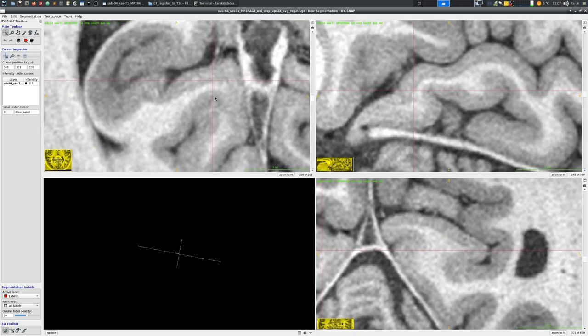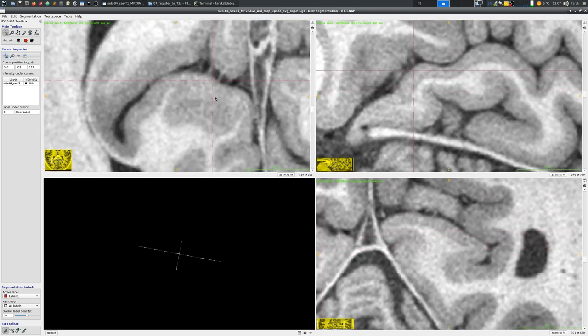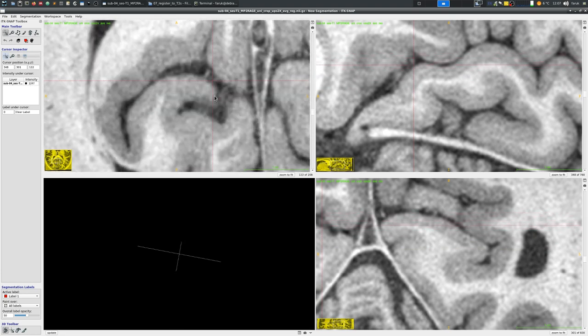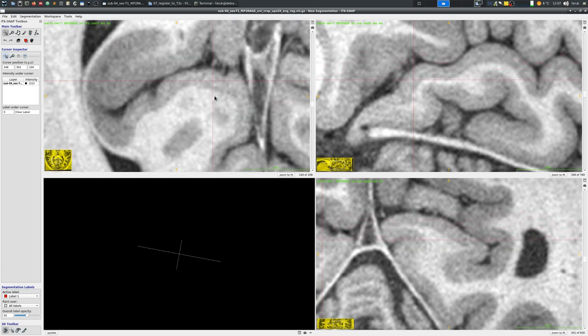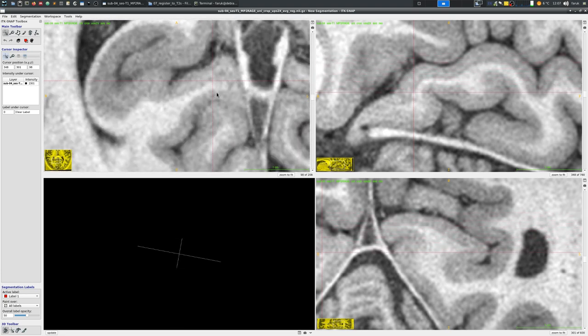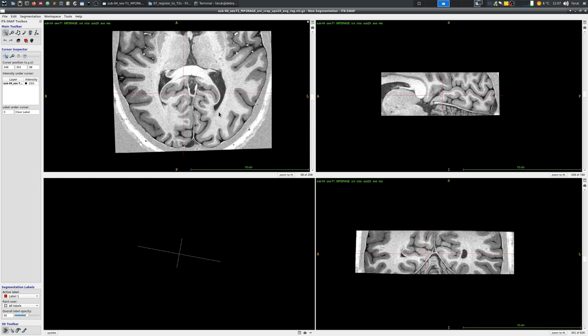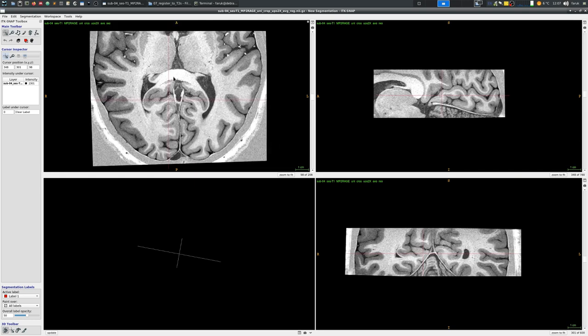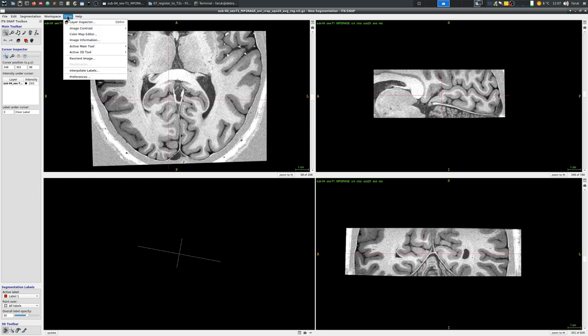Now here I am basically using the mouse wheel button to scroll through different slices of the image. You can also use page up and page down buttons on your keyboard.